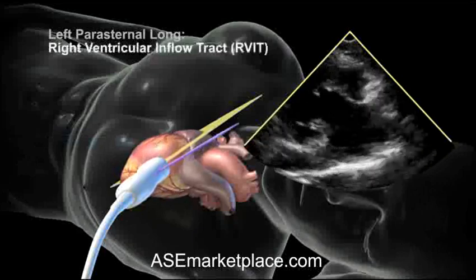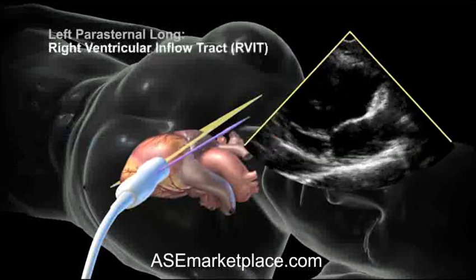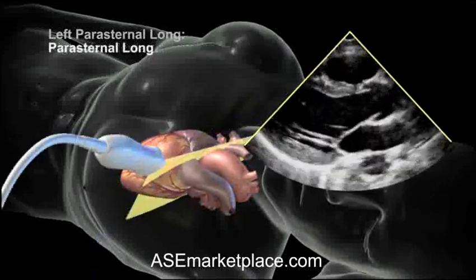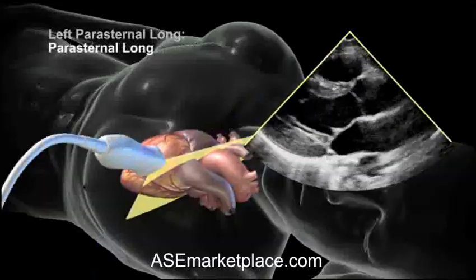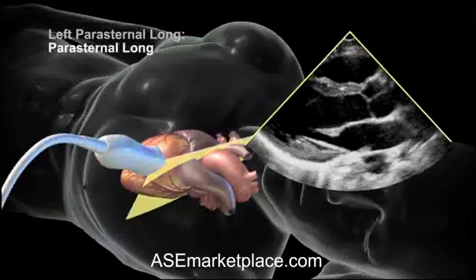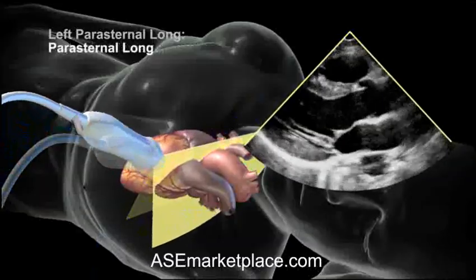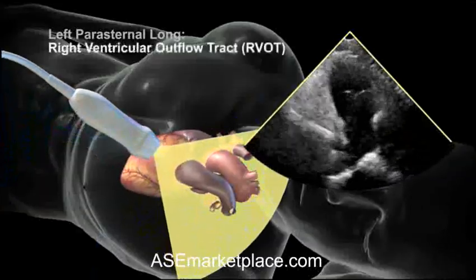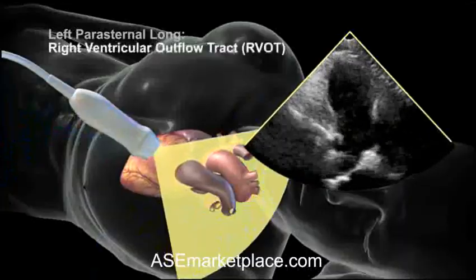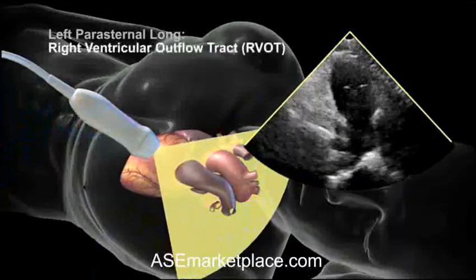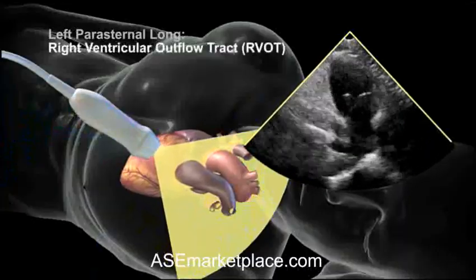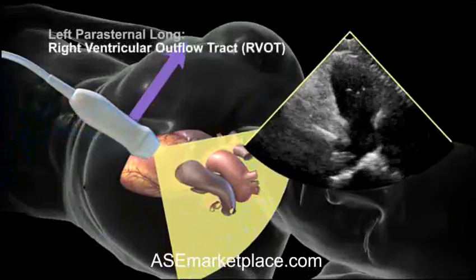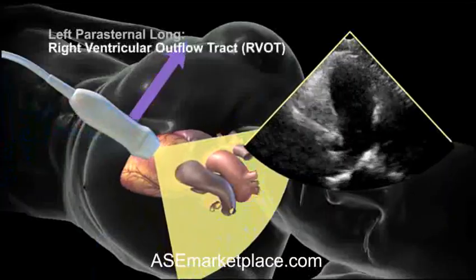Notice that the indicator is still pointing towards the patient's right shoulder. Starting again from the parasternal long view, the transducer is angled towards the patient's right hip to acquire the right ventricular outflow tract, or RVOT view. Notice that the indicator is still pointing towards the patient's right shoulder.